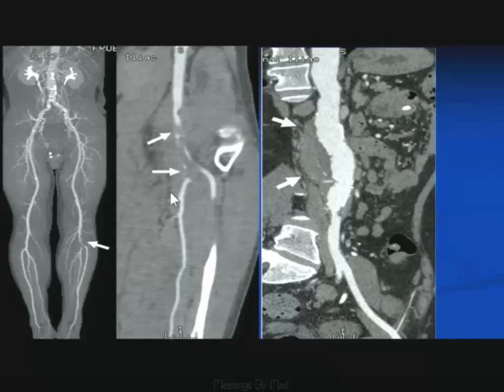So here's an example of a patient who has a fairly acute popliteal artery occlusion, which you can see down here. But it wasn't until we really looked back at the aortic contour on a curved plane appropriately rotated that we picked up this patient has a large thrombosed or partly thrombosed aortic aneurysm. So thrombosed or partly thrombosed aortic aneurysms are not an uncommon cause of having distal thromboembolism. This is just an example. And again, the use of the technique to really lay out all the anatomy and pathology very precisely. So this patient clearly needs an embolectomy, which is done immediately following this type of CT angiogram.